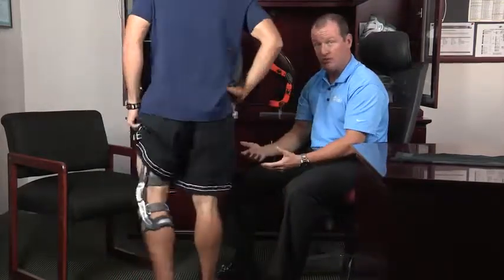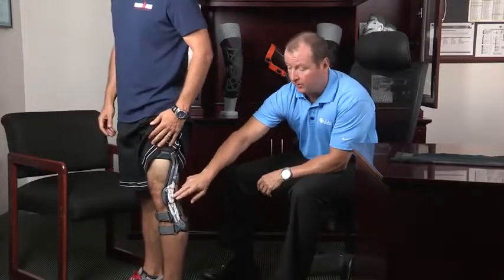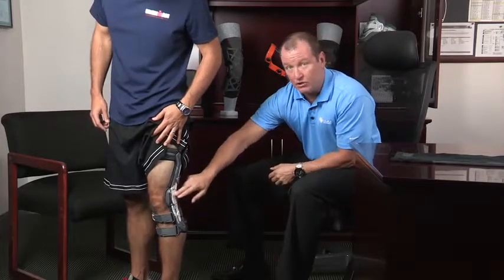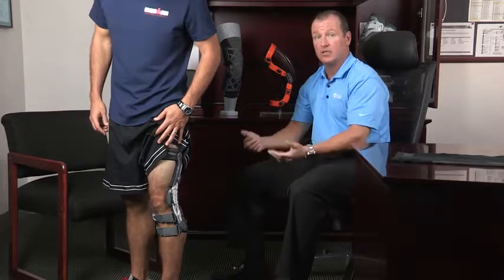One of the things that's really important about the knee brace, as I mentioned about taking stress off the ACL — the hinge that we have here is called the force point. What it does is help take your knee out of what we call the at-risk position. That means as your knee goes from flexion to extension, into full extension, that's when the risk of ACL injury goes up pretty high. This hinge helps dampen you from going into complete extension, helping protect your knee from getting into that at-risk zone.